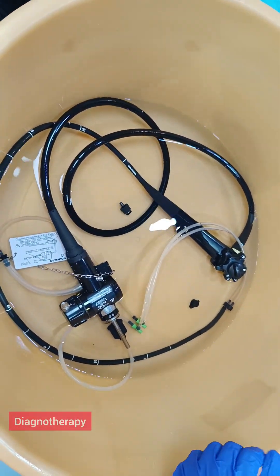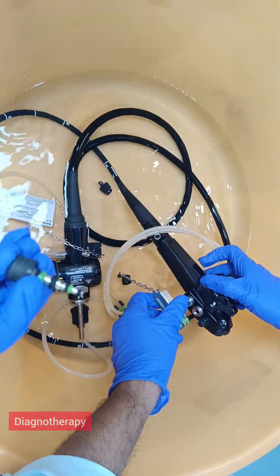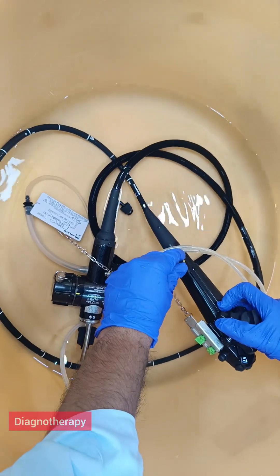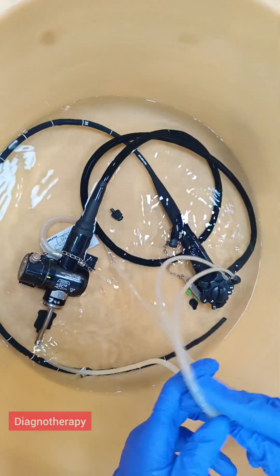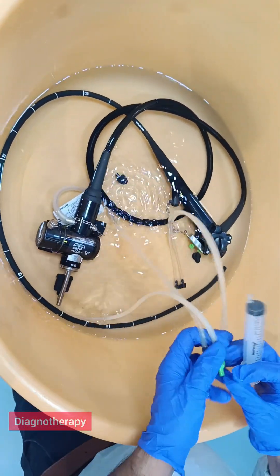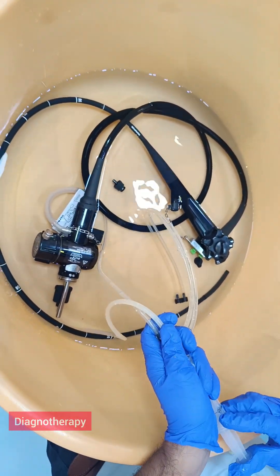Here we need a syringe from this kit and you need to attach it like this. After attaching, the scope should be dipped in water and from here you need to suck and then flush.